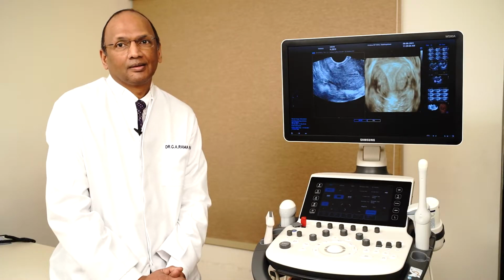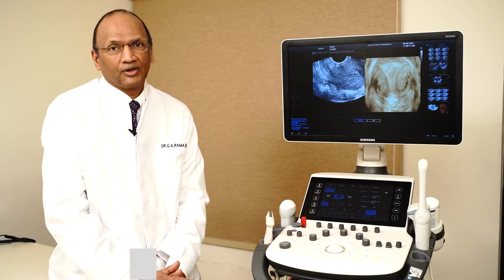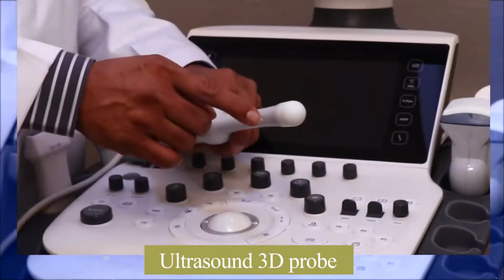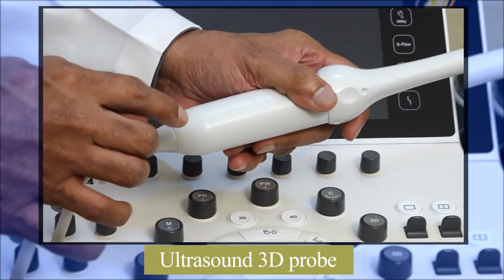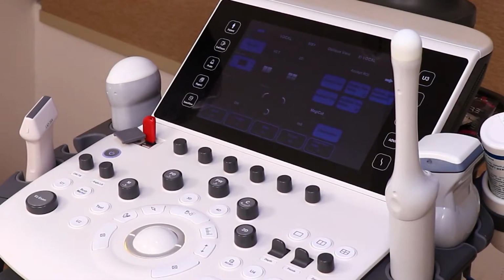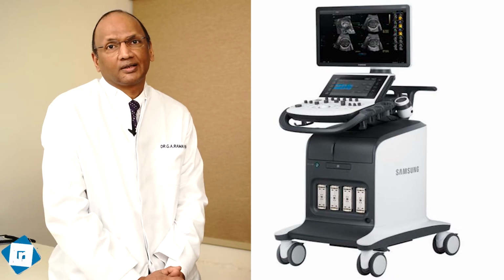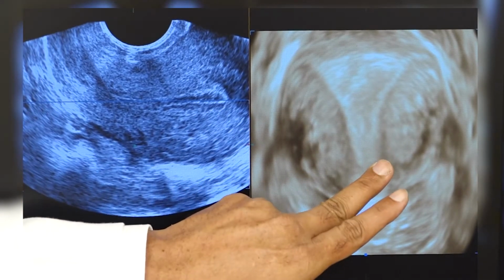We are looking at the role of 3D ultrasound using the 3D probe, which we have discussed earlier. Here we are trying to look at different dimensions of usage of the software that Samsung has developed in their WS80 machine, and let's look at what are the features that are there. Now you have the conventional features, 2D image and a 3D image.